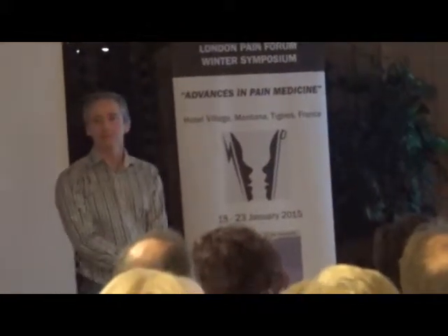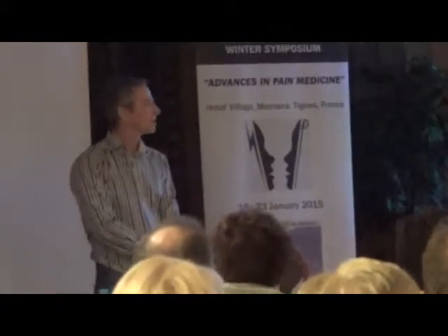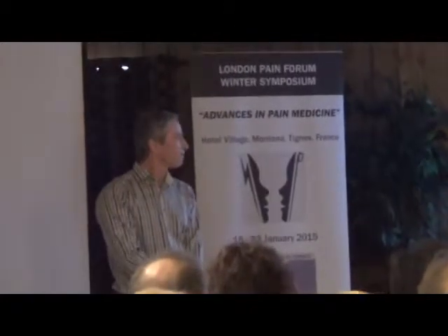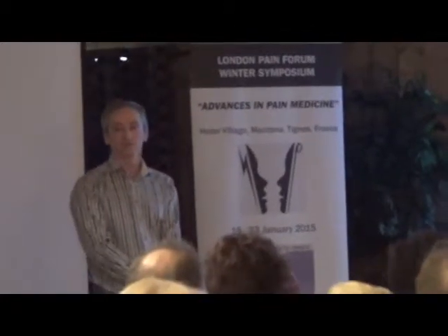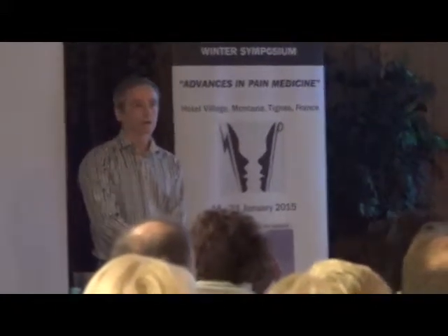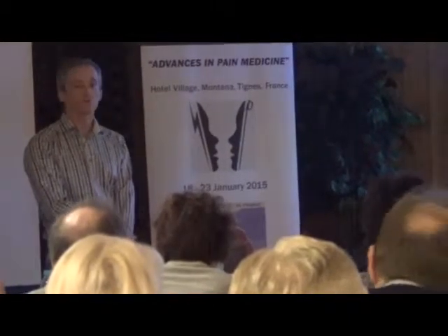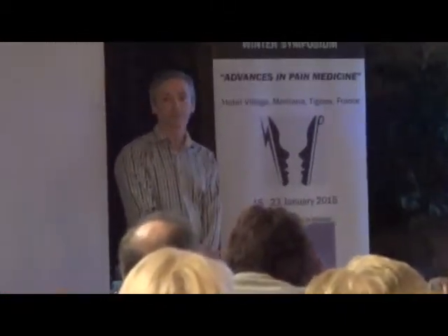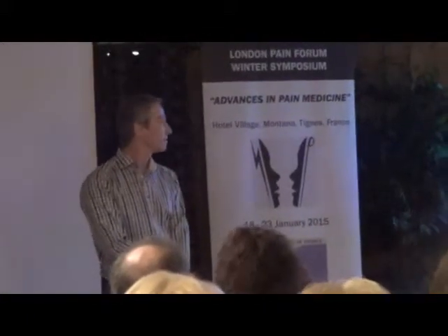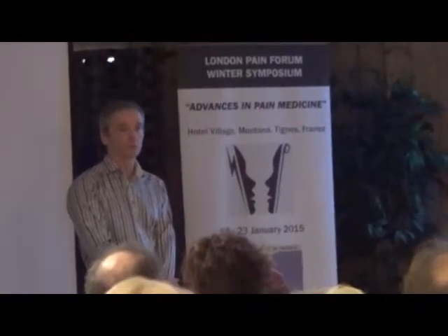When we use loss of resistance techniques, we depend on tactile sensation. You have to feel this dramatic change in pressure. But for a few reasons, it's not reliable in the cervical spine. Ligamentum flavum is not fused. Epidural space is narrow. Ligamentum flavum is thin. So it's easy to miss it. And the consequences are too high. You can get paralyzed or even dead. So why not use something more reliable? Why not use our visual abilities?